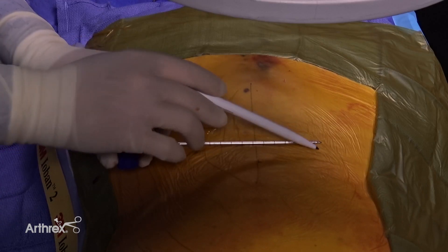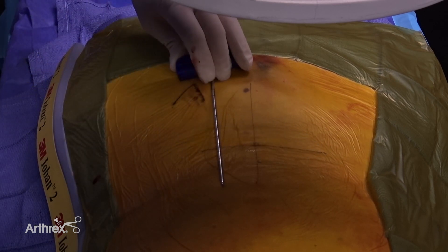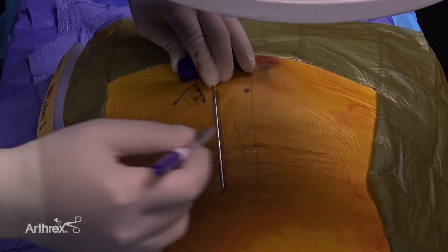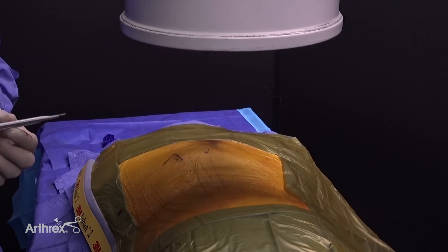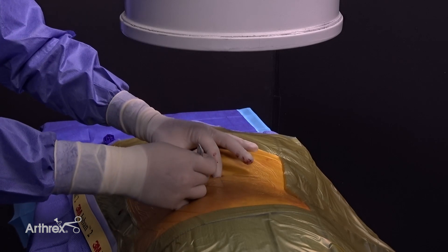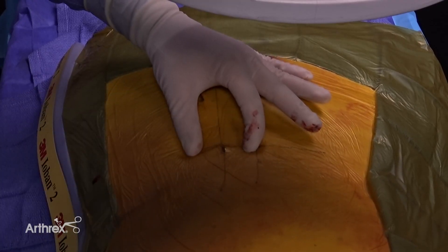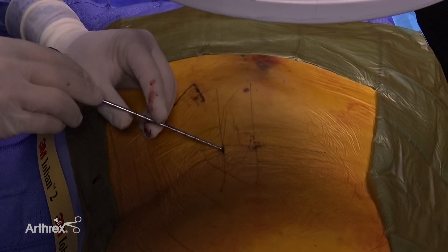The trajectory line is drawn and the instrument is then placed just outside the transverse process to create a target line. The target line is determined in relation to the patient's depth. The intersection of the trajectory line and the targeting line is the starting point. Using a 15 blade, an incision is made over the starting point all the way down through the fascia.